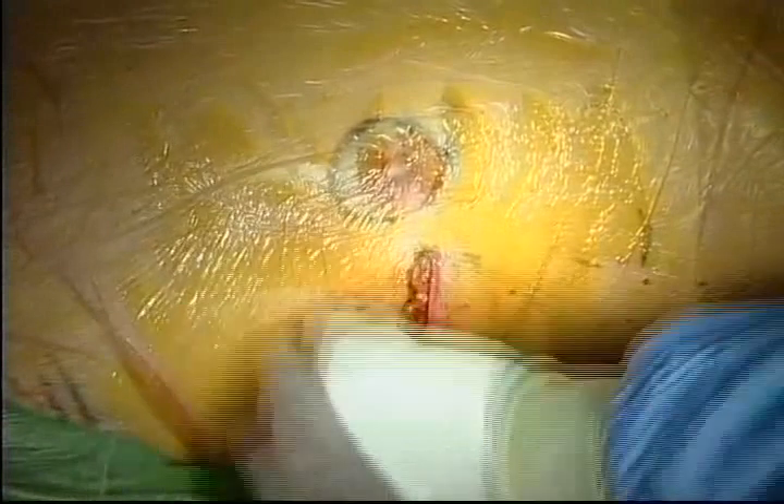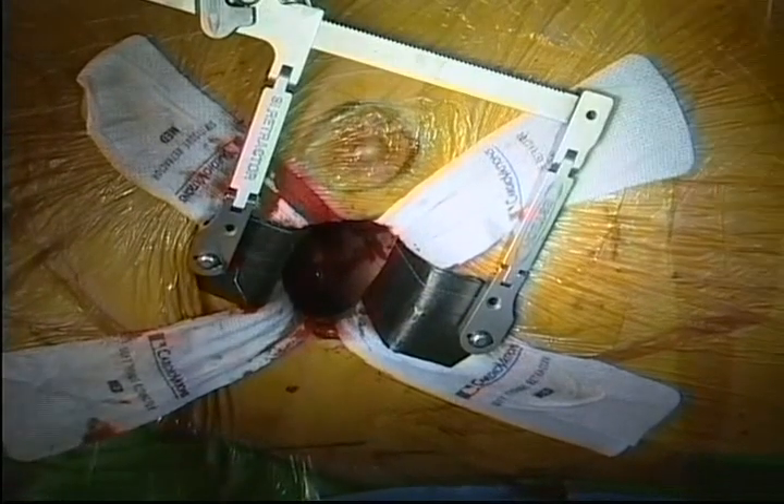After entering the chest cavity, the skin is painted with benzoin so that the soft tissue retractor will maintain excellent visualization. With a medium soft tissue retractor in place, a specially designed small chest wall retractor is positioned.